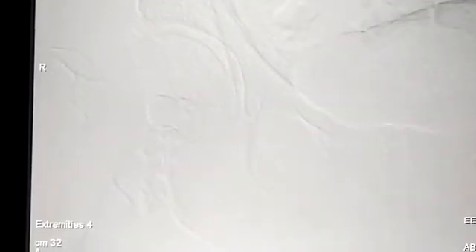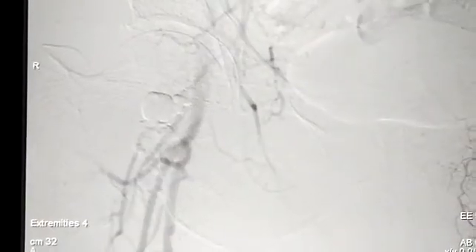We have deflated the balloon and taken it out. The final check angiogram demonstrates complete cure of this pseudoaneurysm and there is no reflux of the glue into the normal vessel. So we have preserved the normal vasculature and gotten rid of this pseudoaneurysm with balloon-assisted glue embolization of the right groin pseudoaneurysm following a percutaneous IABP placement.